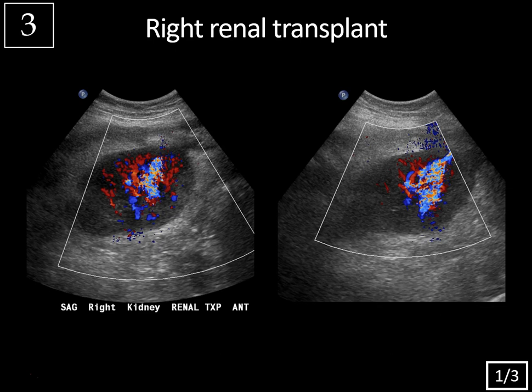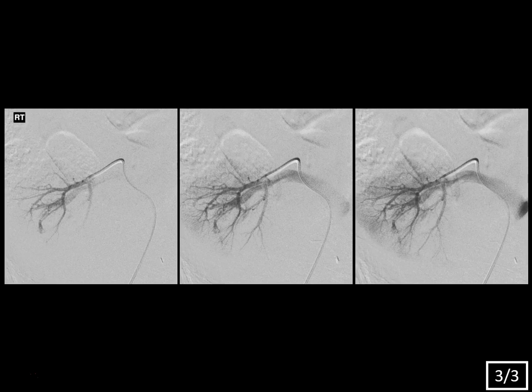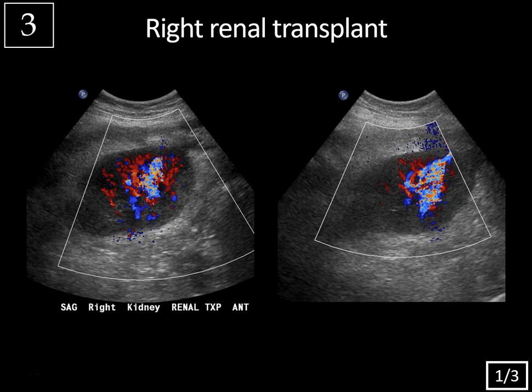Case 3: renal ultrasound, history of right renal transplant. You might be thinking this looks like the previous case — and there is a very similar color Doppler appearance with turbulent multi-directional flow causing a visible thrill and tissue reverberation in the surrounding parenchyma — but bear with me, this is a little different. The clue here is that this is a renal transplant.